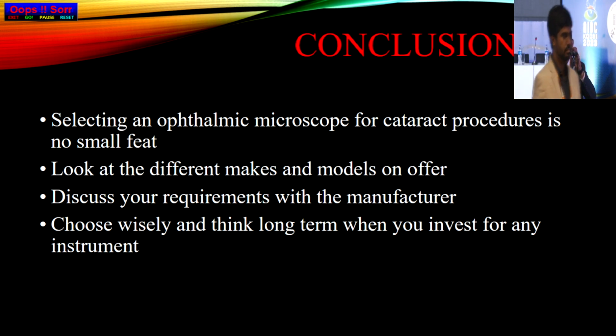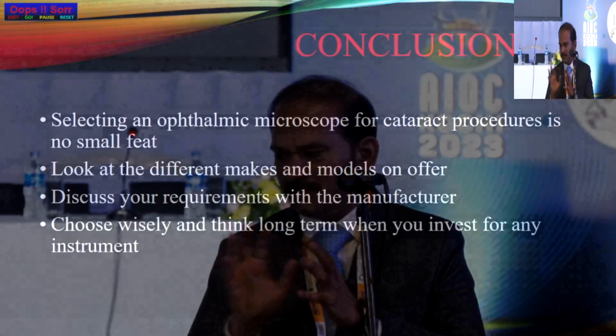Maintenance part, definitely there are some things which I want to add. One, definitely don't use an alcohol based cleaner. It is better to avoid physically rubbing it also. Always just blow off the dust that is available. Second thing is, as I was mentioning, there will always be a fungal issue with microscopes, because there will always be a fan which keeps cooling the head.